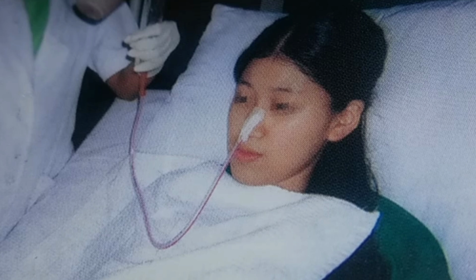Then place the container with the feed in warm water. We can't give cool food. We have to provide only normal temperature food to the patient. Then we have to put the patient in a comfortable position, that is the Fowler position, 35 to 45 degrees. Why are we making this position? To prevent the risk of aspiration.